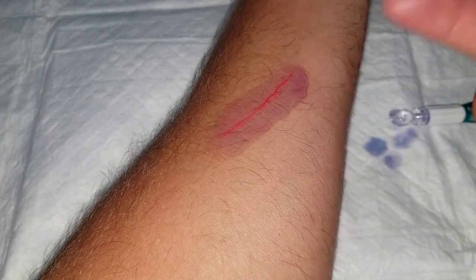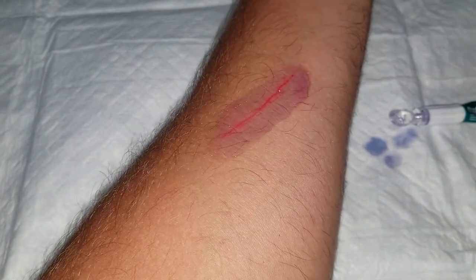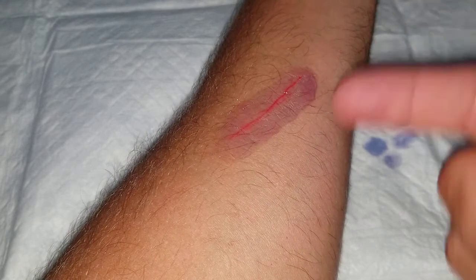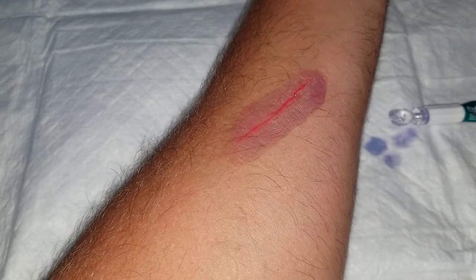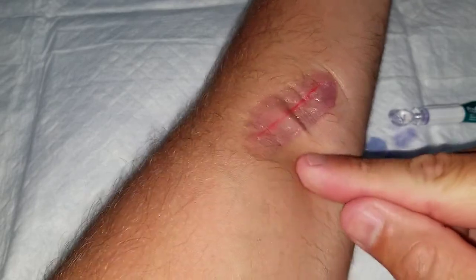If you don't give it enough time to dry, it will be dry on the outside but not the inside. It'll be almost like a gel substance. So you don't want to start peeling that, because it's almost like that booger glue on the back of credit cards. So you want to give it ample time to dry. I'm going to give it a good minute to dry before I start messing with it to try to remove it.